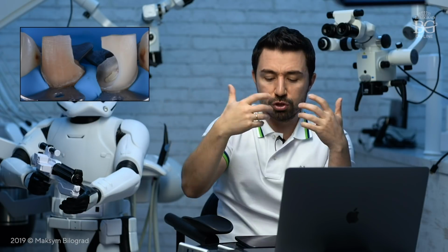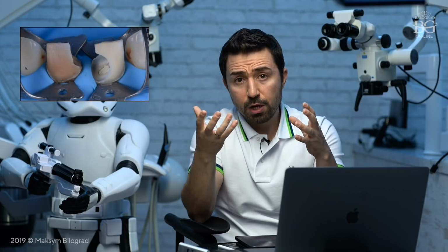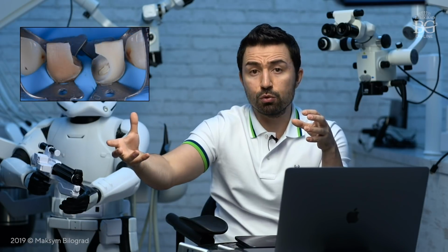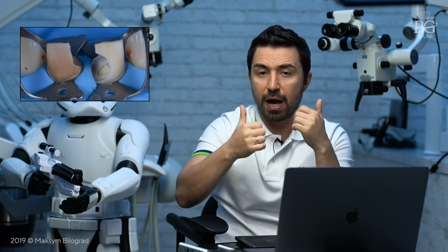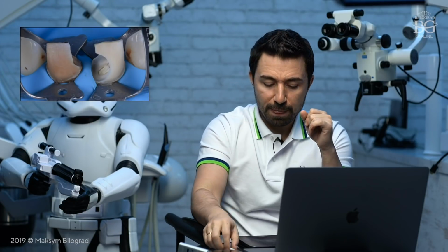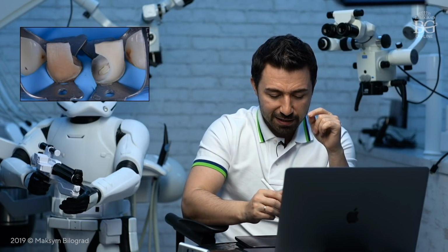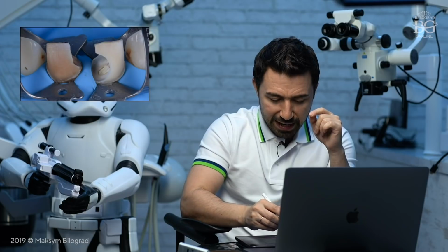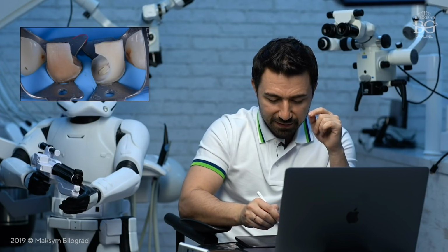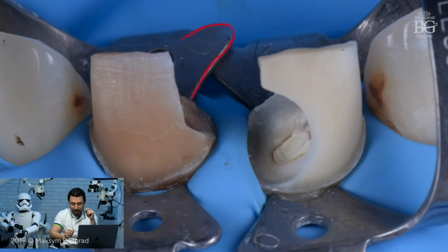I was trying to use flowable composite with the arch of the clamp to bond this to the adjacent tooth. I was trying floss ties or whatever, and it didn't work until I found, again accidentally, the trick that the wing of this clamp actually stabilized that one from moving up.